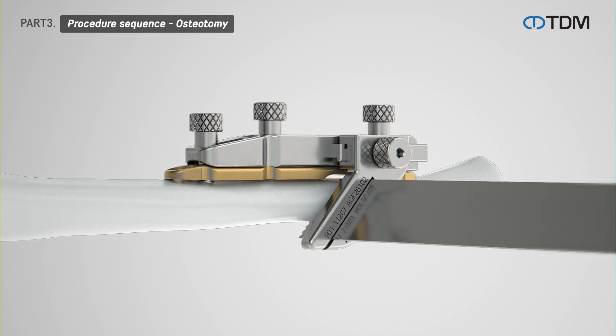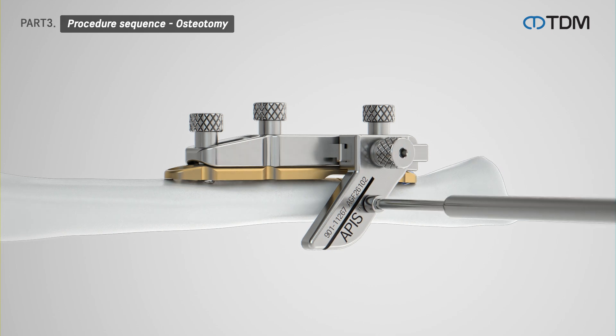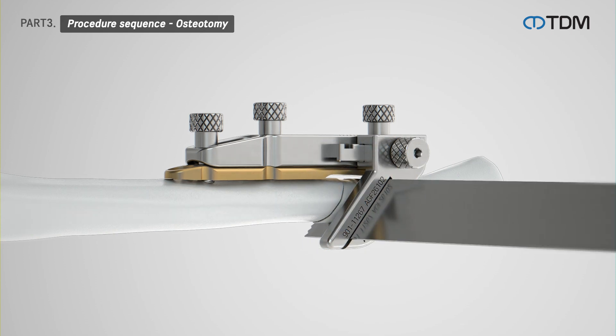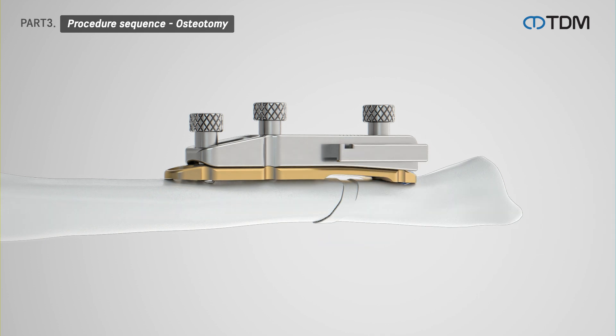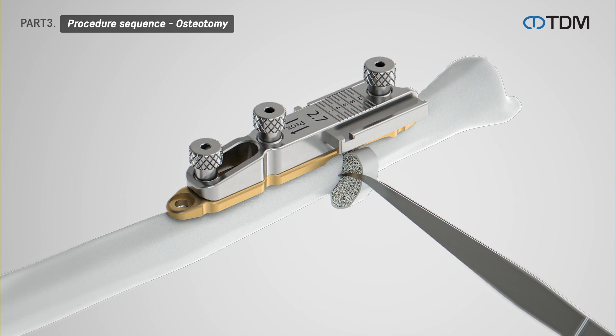Cutting is initially done at 0 millimeters using a 0.4 millimeter thick saw blade. Then, adjust the cutting guide to the desired dimension and perform another cut. Finally, remove the cut bone fragments.